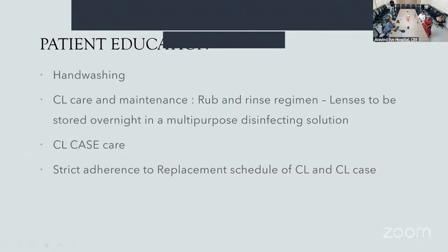So what are the important points before you prescribe a contact lens? You should always stress the compliance of hand washing before insertion and removal of the contact lens. And for contact lens care and maintenance, the rub and rinse regimen should be followed every time.